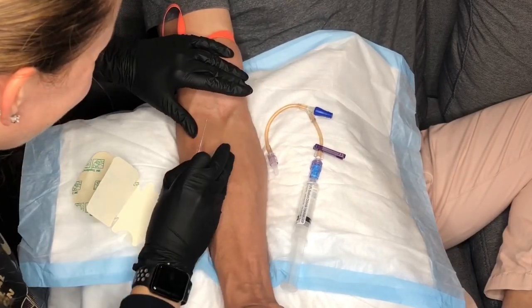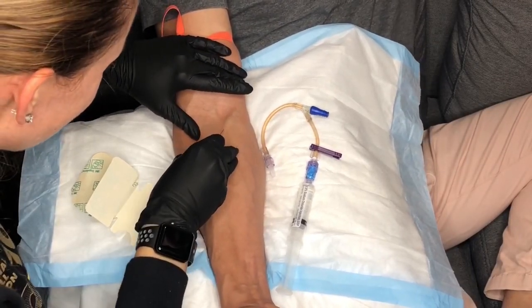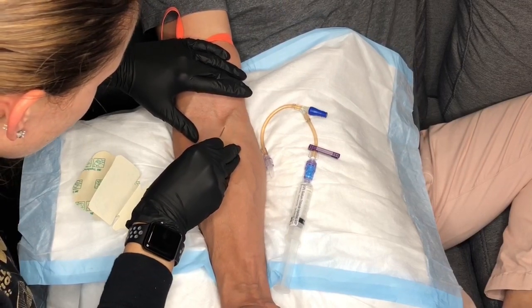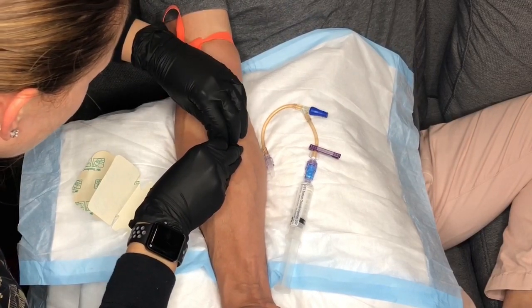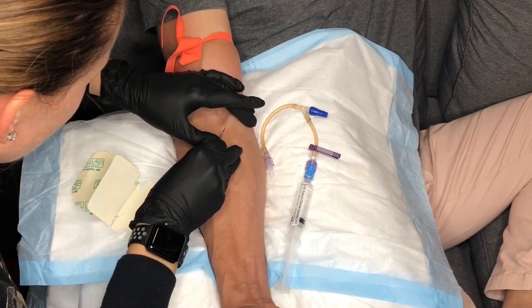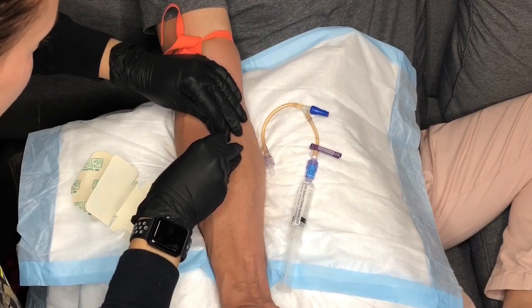As always, you want to stabilize and support the vein by using both hands. Once you get the flashback of blood, continue advancing the needle another one to two millimeters and then extend the catheter through the vein.